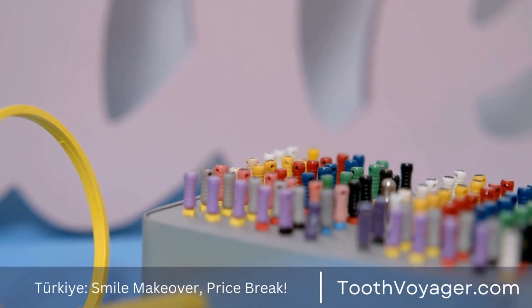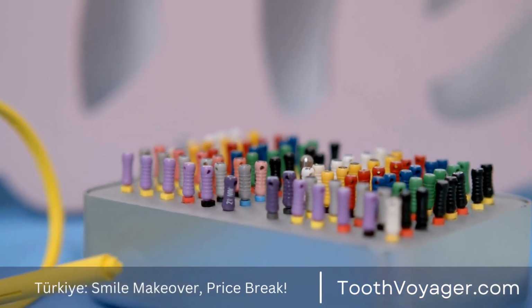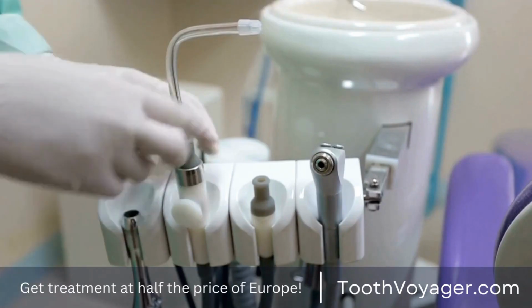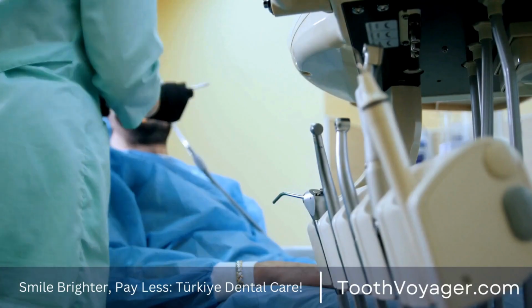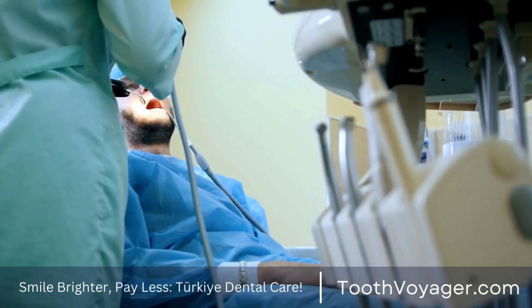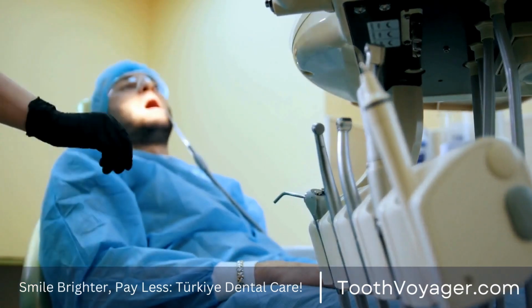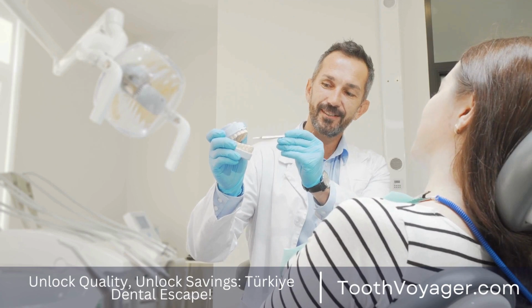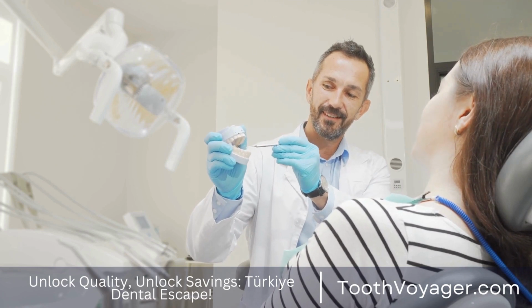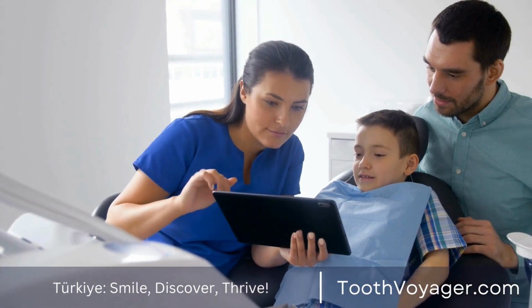Implants for dental purposes. An implant made of metal is surgically implanted in the jawbone. This is used as a replacement to the tooth's root. When the implant has fully established itself and is able to fuse with the jawbone, the crown is connected to the surface of the implant in order to complete the procedure. The crown is customized in order to mimic the appearance and color of the patient's teeth. It is a smooth and natural-looking substitute tooth.